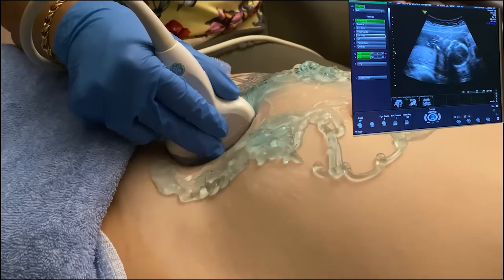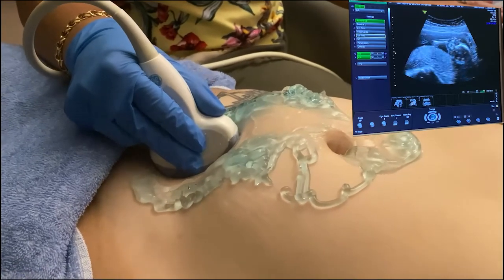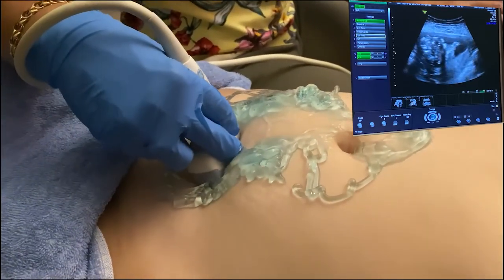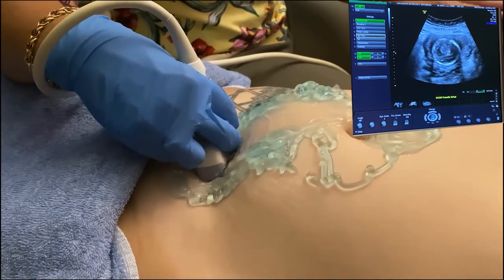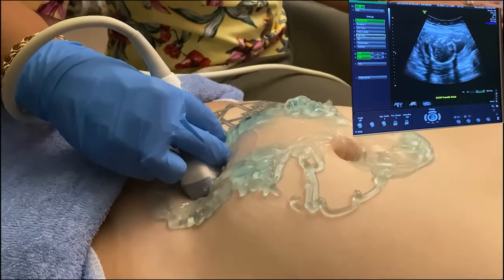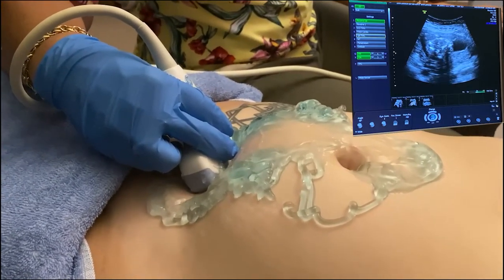But what we're doing here primarily is to get situs. So we have the head, and we see that when I go from 12 o'clock to 9 o'clock, the baby's head is turned as we go to the orbits, and it's actually looking out mom's left side.